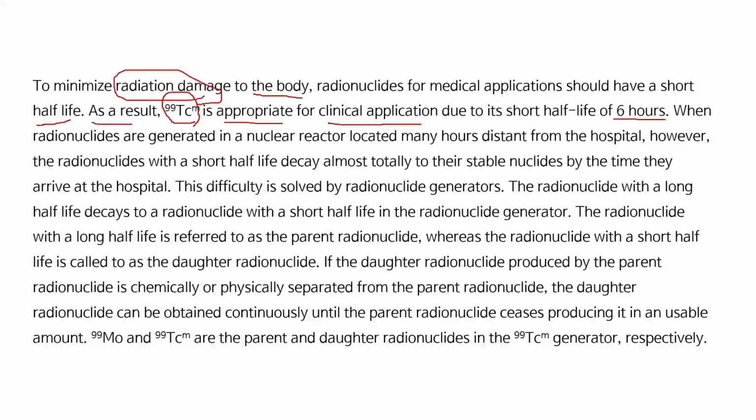When radionuclides are generated in a nuclear reactor located many hours distant from the hospital, however, the radionuclides with a short half-life decay almost totally to their stable nuclides by the time they arrive at the hospital. This difficulty is solved by radionuclide generators.